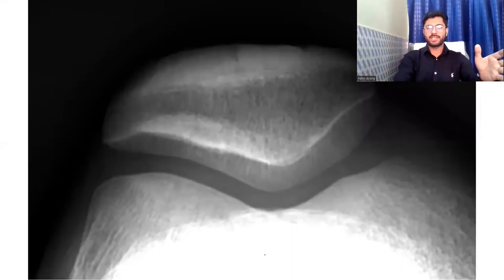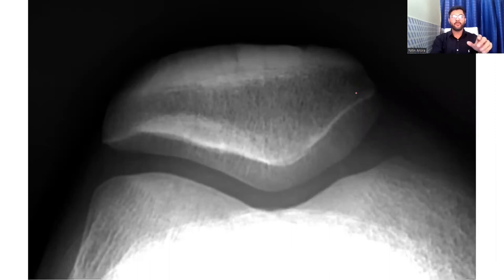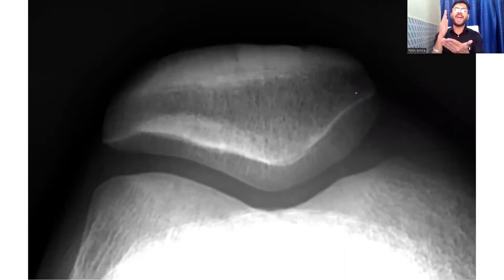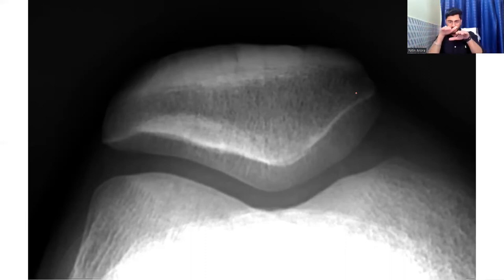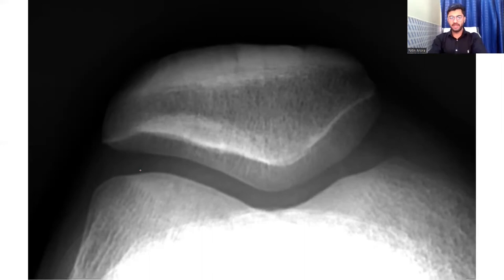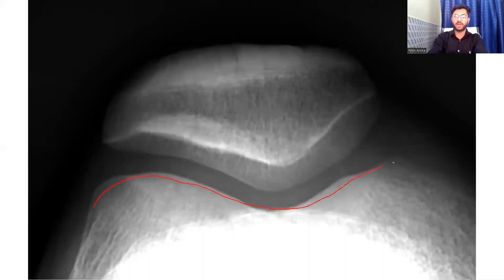Last but not the least, here you can see the skyline view of the knee joint. This is a type of x-ray you order if you do not see anything on the AP view or the lateral view. Skyline means a view from where you can see the top of the patella clearly. Over here you can comment on parts that are not visible in either AP view or lateral view — on this skyline view you can see the posterior part of the patella and the entire femoral condyles.